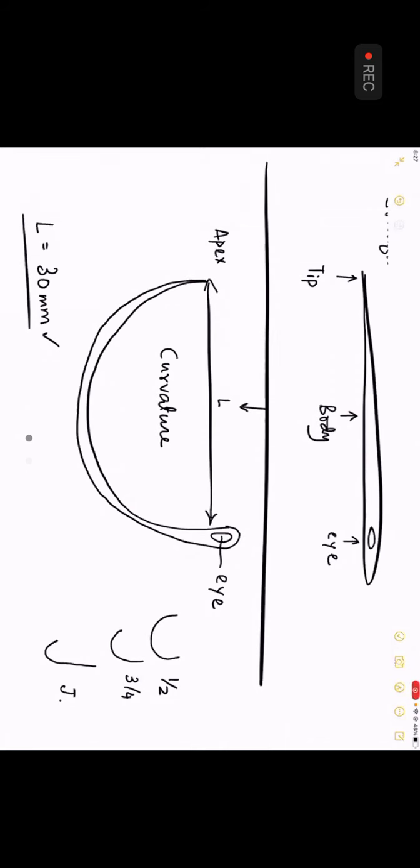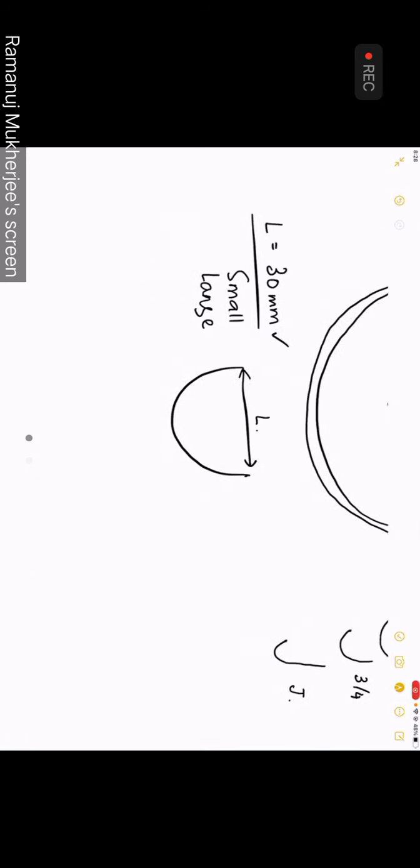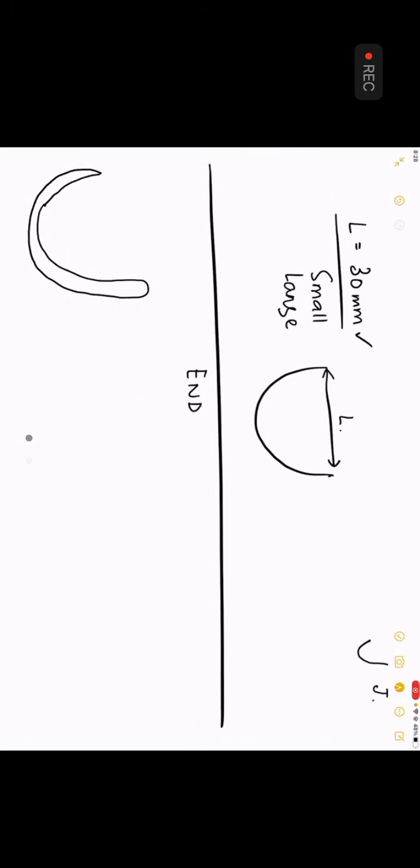So the logic is very simple. The lesser the size, the smaller the needle. So for small and large needles, all that matters is this point called L. Finally, we come to the two ends of the needle before we come to the tip. The ends of a needle can have two kinds of arrangements. Look into that.